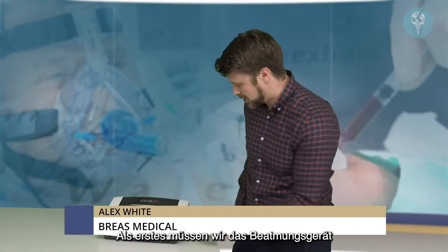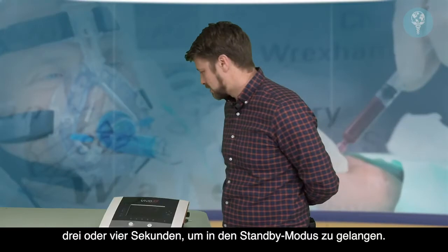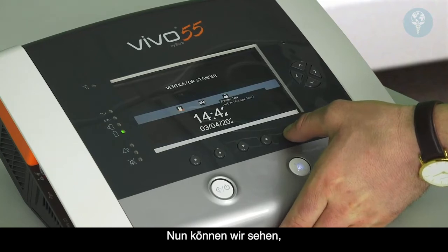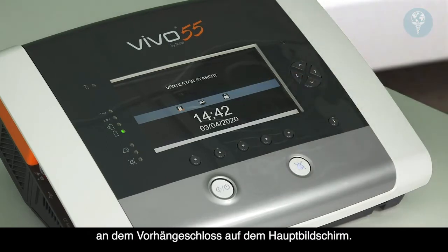So in this video, we're going to set up a patient prescription on the Vivo 55. The first thing we need to do is turn the ventilator on via the button on the side. It will take 3 or 4 seconds to go into standby mode. Okay, so at this point, we can actually see that the Vivo 55 is in the home mode. So that's just denoted by the padlock on the main screen there.